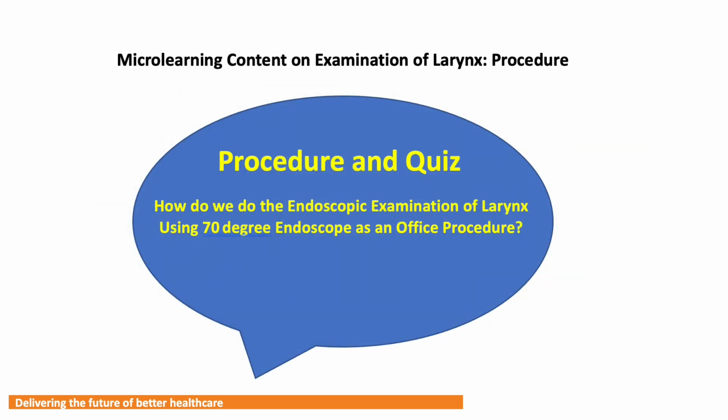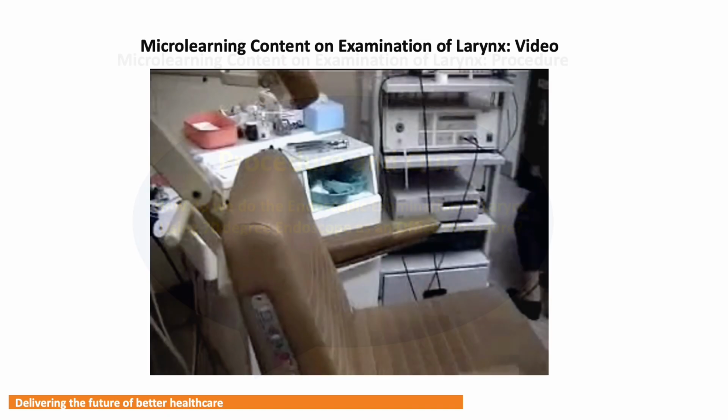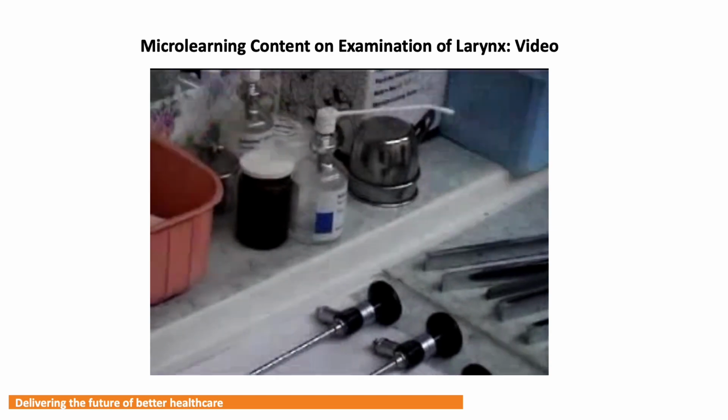Now it's time to watch the procedure and take your quiz. The quiz items of the question will appear during the video. You may pause and take down your answer, and you may check your answer provided towards the end of this video in a tabular form. Please bear with me the background noises because the intention was to show you the real-time video. And please also take note of an ENT clinic equipped with endoscopic procedures. This is the spray.